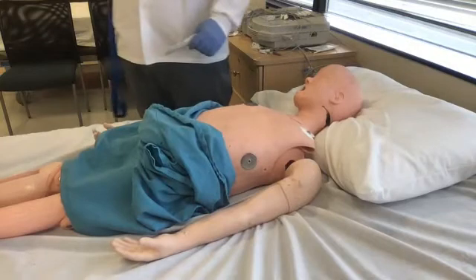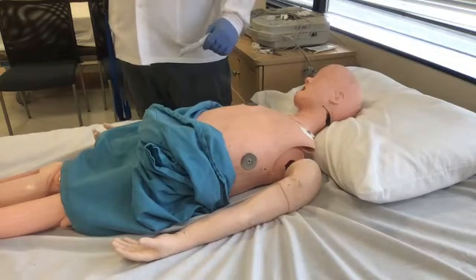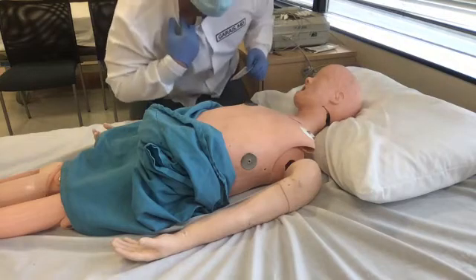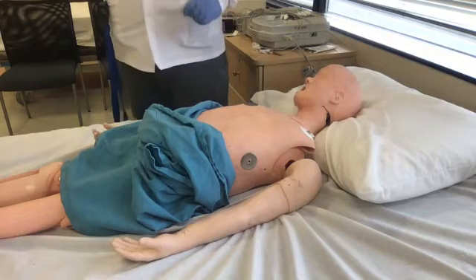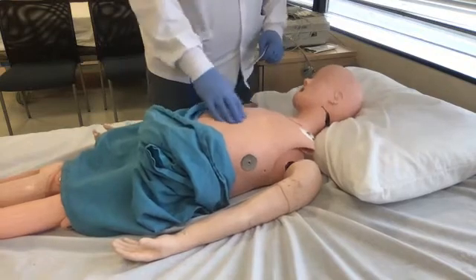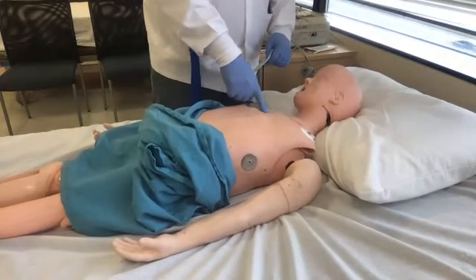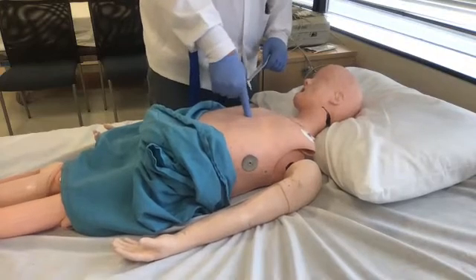Now, how you measure? Everyone touch their right collarbone, also known as your clavicle. You feel that? There's a notch. And for those of you at home, touch your right collarbone. And then there's a space right underneath. That space is your first intercostal space. And if you remember the chart, you could feel your breastbone here, which is your sternum. I'm feeling on the right collarbone: first intercostal space, bone. Second intercostal space, bone. Third intercostal space, bone. Fourth intercostal space.